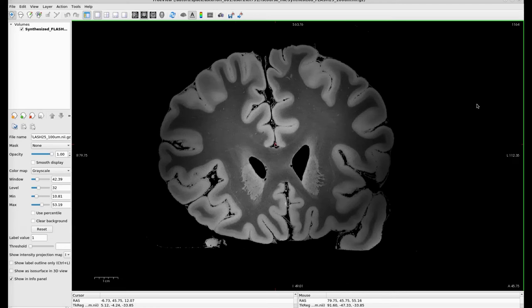Hello everyone, my name is Kim and I work on the FreeSurfer team. Today I will be giving you an overview of the subcortical neuroanatomical structures in the human brain. This beautiful volume I've got loaded here is part of a paper published by one of our collaborators, Dr. Brian Edlow et al., and it is an ex vivo scan of a human brain with very beautiful resolution, which I'm using today to give you a high-resolution tour through the human brain.